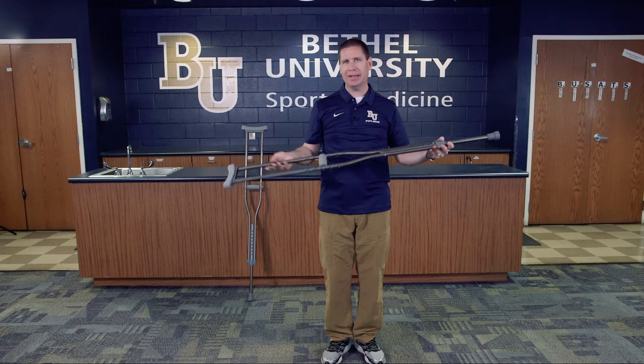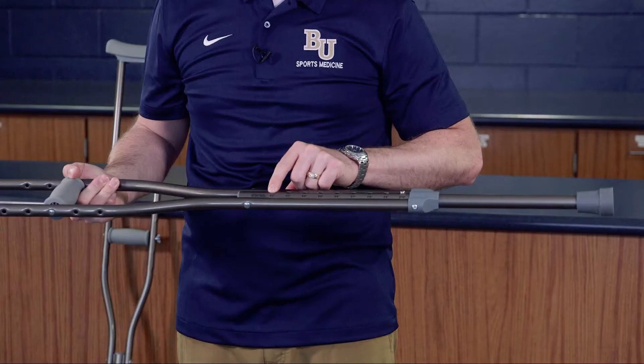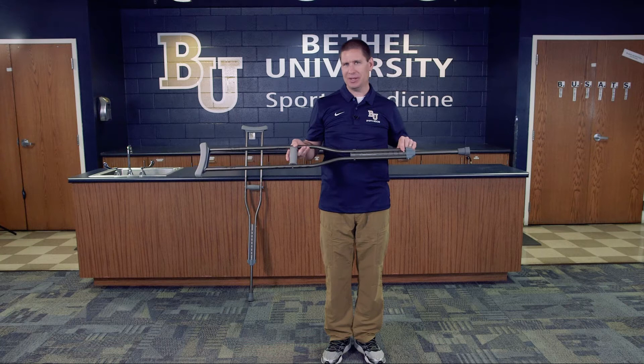Most modern day crutches put a measurement reading on them — it says five two, and then at inch increments all the way up to five foot ten inches tall. I'm going to start with the assumption that five foot ten is my height, which you can ask the athlete, or you already know, and then set the crutch appropriately.